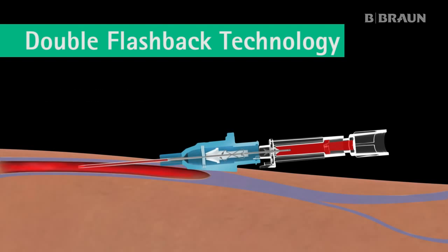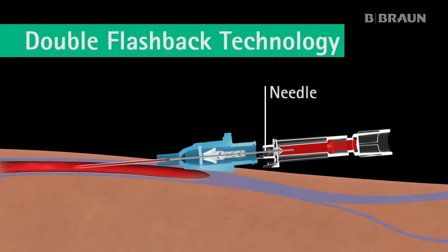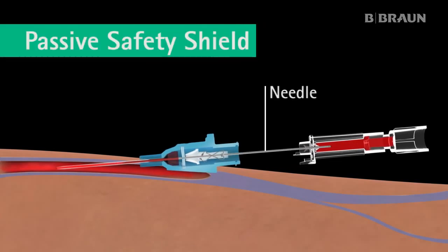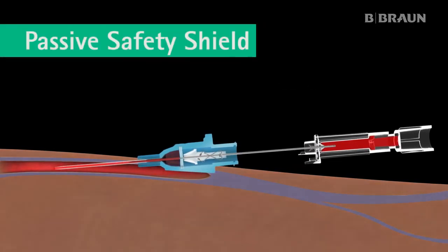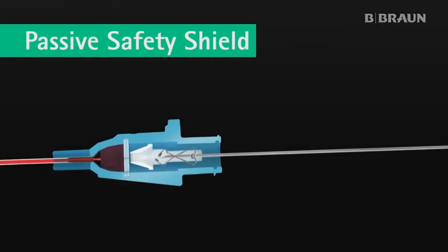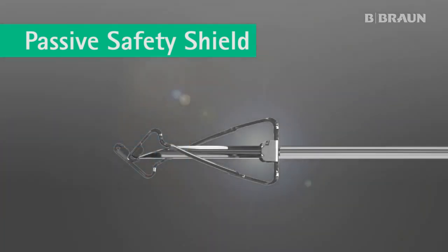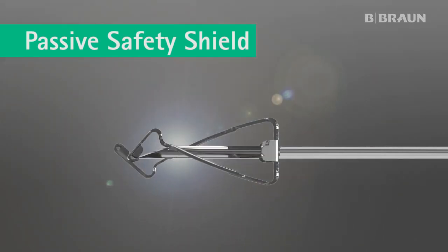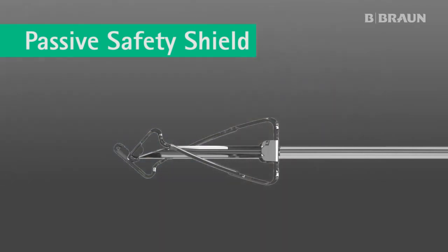Once the catheter is advanced completely, the needle is withdrawn straight out of the hub in a controlled and continuous motion. The passive safety shield engages as the needle tip passes through the catheter hub. It deploys automatically and permanently shields the needle tip. This passive safety feature cannot be bypassed and is designed to protect against needle stick injuries.